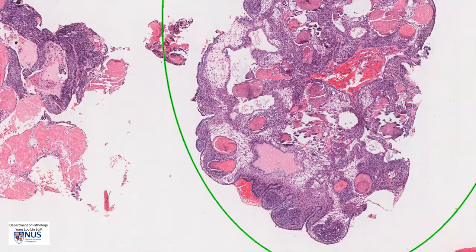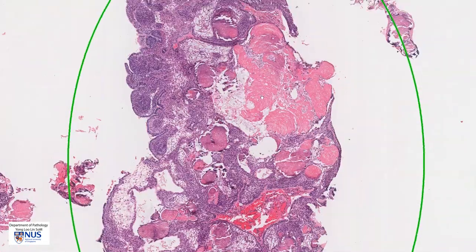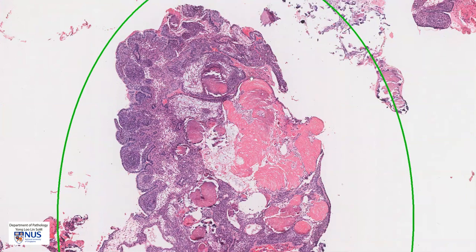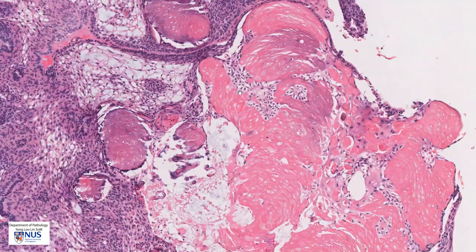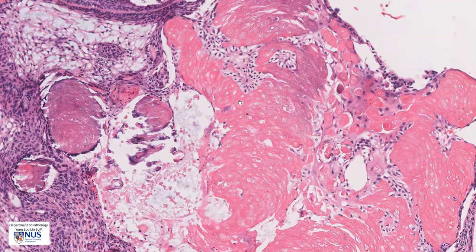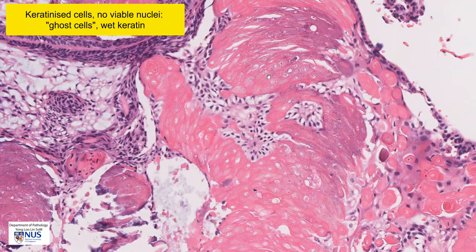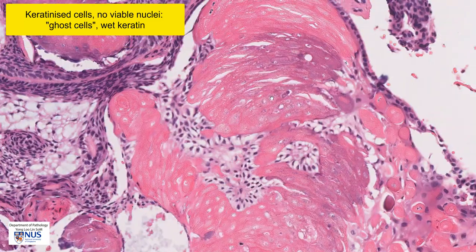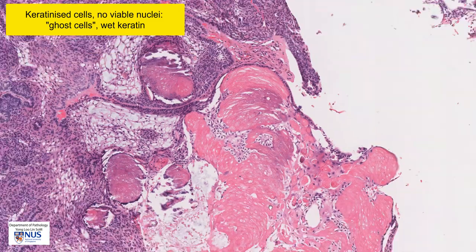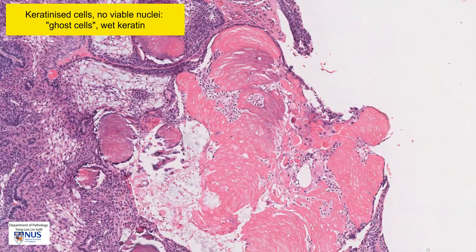Now let's look at the pink areas. These areas are actually formed from sheets of keratinized cells. However, the thing that is missing are the nuclei, so these are known as ghost cells. Sometimes you can actually almost see the little residual nuclei dropping off. And this type of keratin is known as wet keratin.